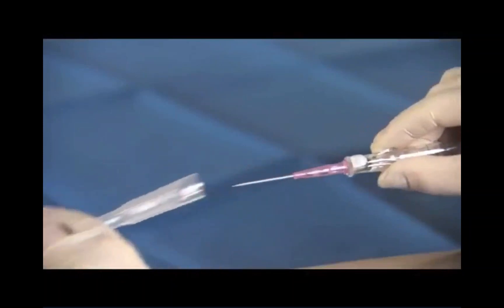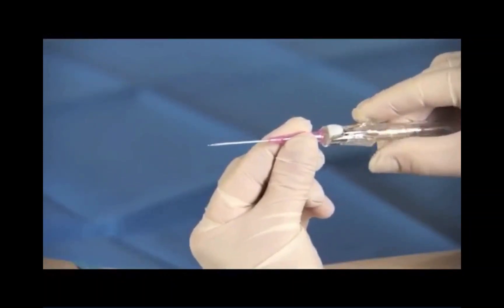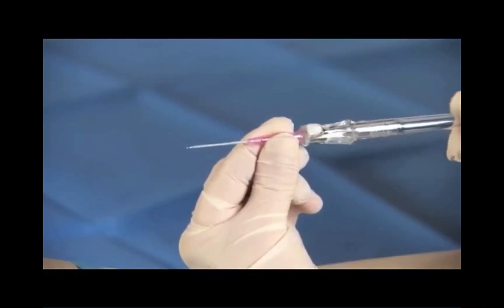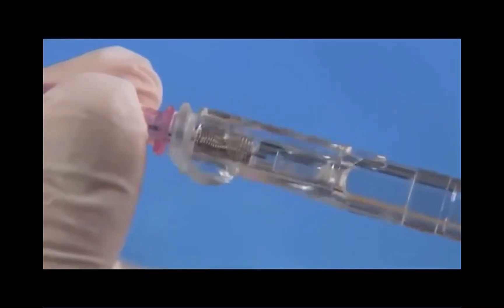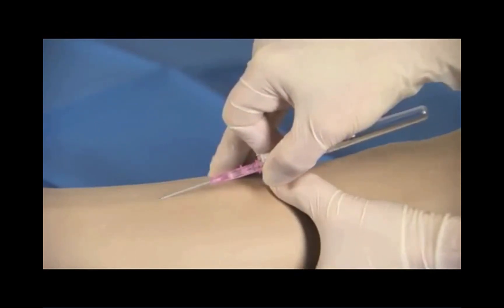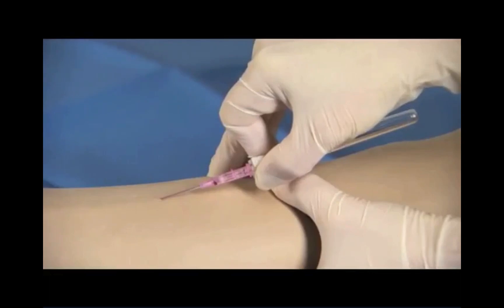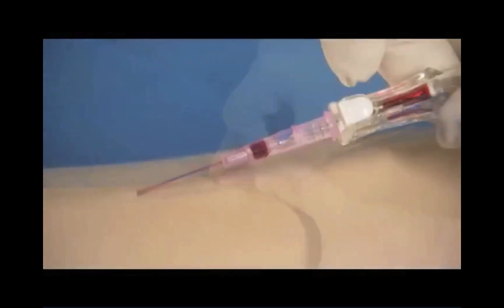Remove the needle cover in a straight outward motion. Holding the catheter hub, rotate the barrel 360 degrees to loosen the seal. Make sure the push tab is facing upwards and the catheter is seated back in the notch. Stabilize the vessel and perform the venipuncture. Look for initial blood return along the catheter in 20 through 24 gauge catheters, then in the flash chamber behind the white button.